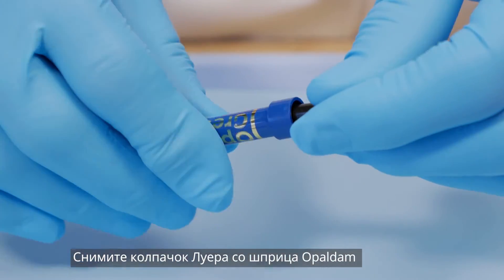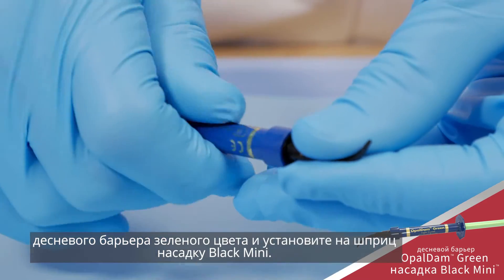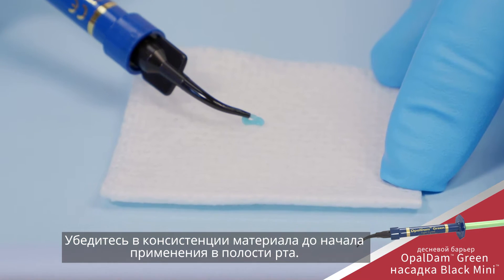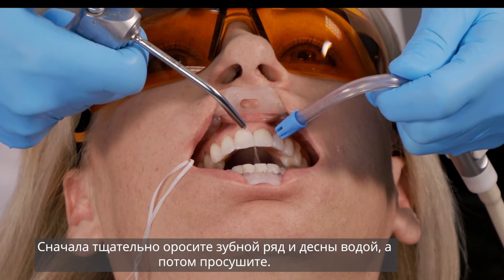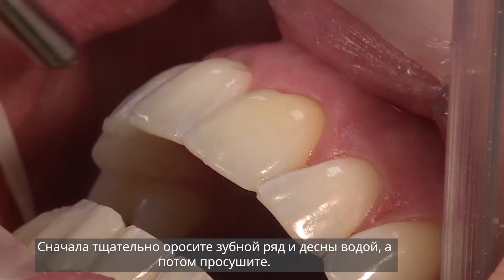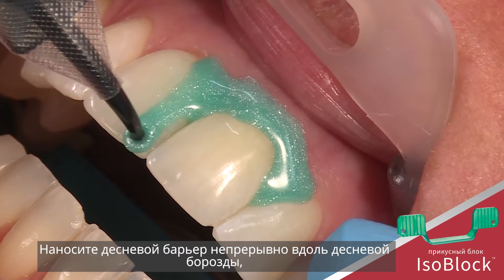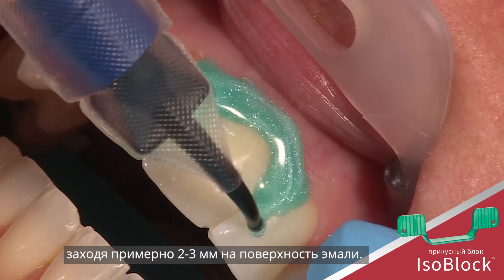Remove the LuerLock cap from the Opal Dam Green Resin Barrier Syringe and securely attach a black mini tip. Verify flow prior to placing intraorally. Rinse and air dry the teeth and gums thoroughly. Express a continuous bead of Opal Dam barrier along the gingival margin, overlapping approximately 2 to 3 millimeters onto the enamel.